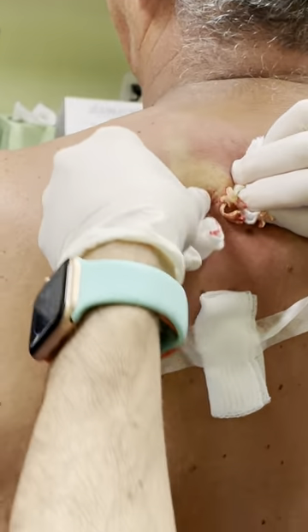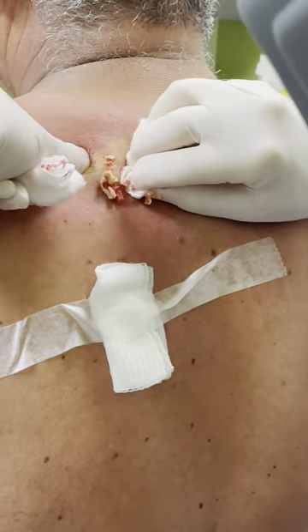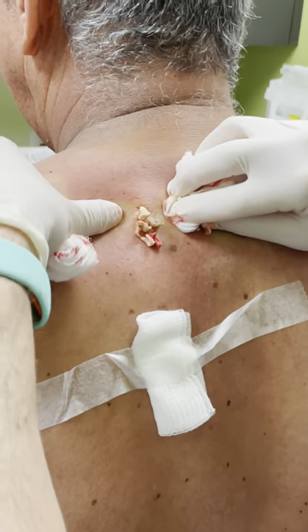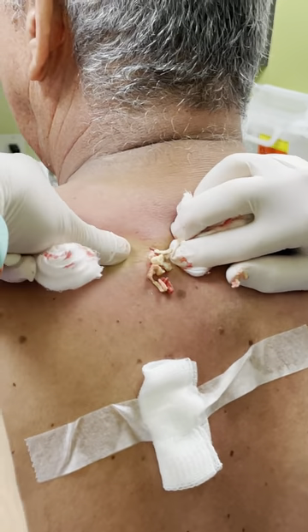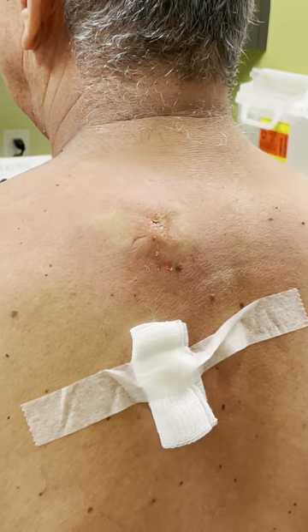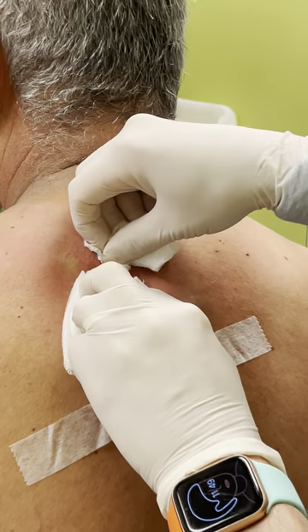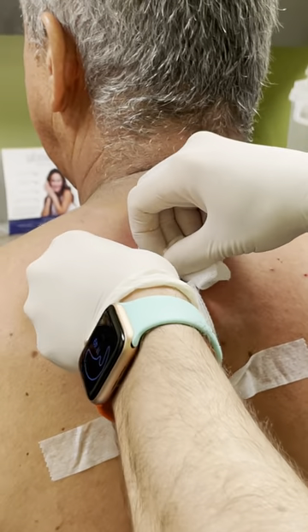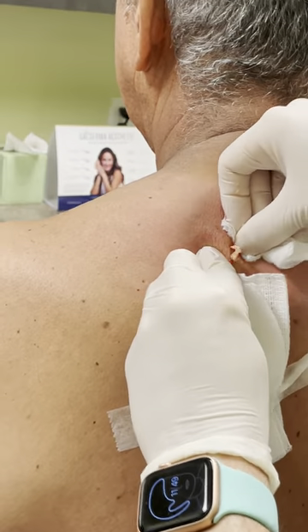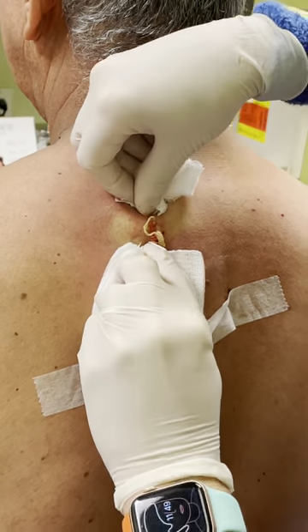No pueden comerlo! And it requires some elbow grease really to get it out. You got a good view of it there, Tati. You can really just see how lovely. We'll get some more peroxide on the gauze so we get a nice clean field. And you can really smell it — I wish you could smell what we're smelling here, because there's a special odor to it. We'll certainly spray the room down afterward.